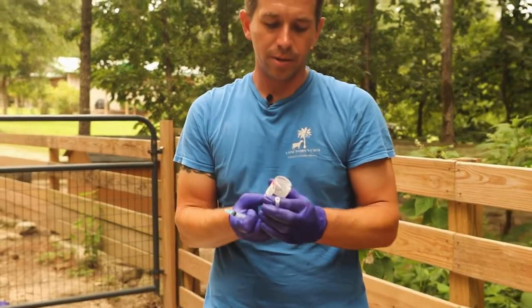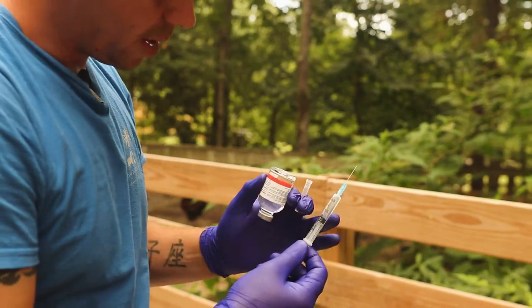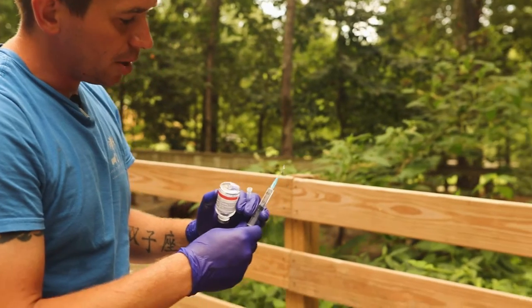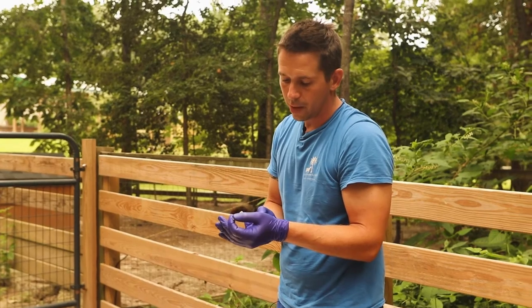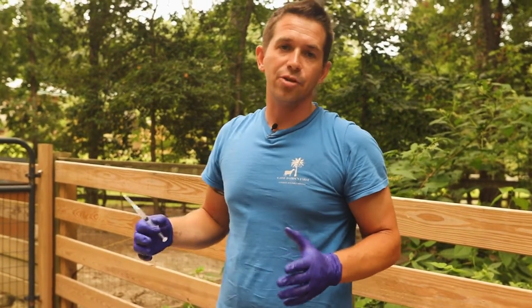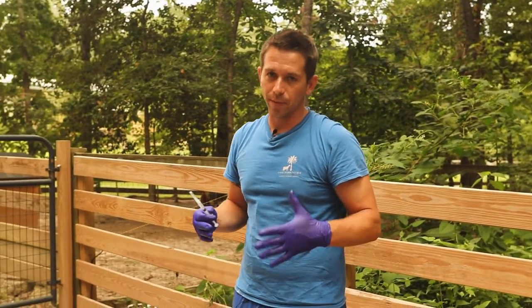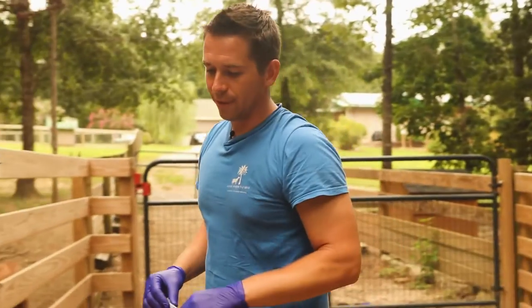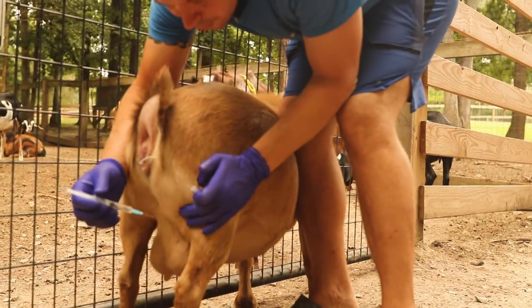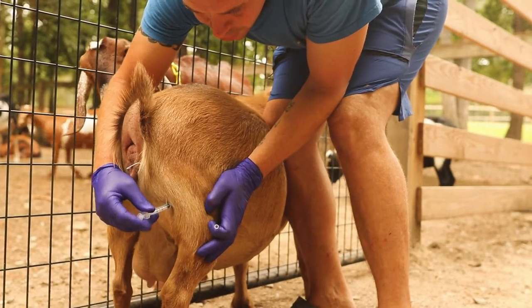We've got our sterile needle and our Lutalyce. It is two mls per goat. Go ahead and draw that up. Now anytime you're giving a hormone injection, 99.9% of the time everything I know of is going to be IM — intramuscular. The most common spot for intramuscular on a goat is either in the neck or in the back leg. I personally prefer the back leg because I'm normally working by myself and there's no chance of hitting the jugular in your back leg. So we're going to go ahead and give her this shot of Lutalyce. I just like to tap her a few times before I give it.